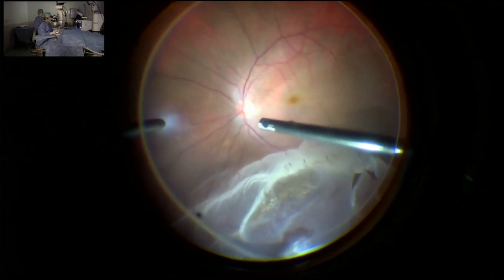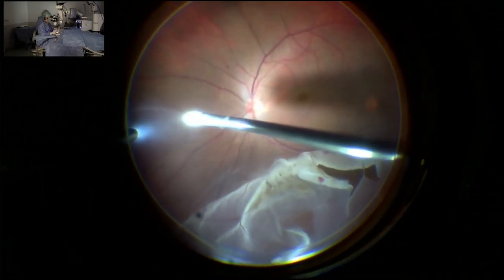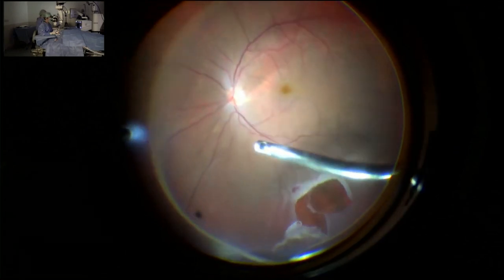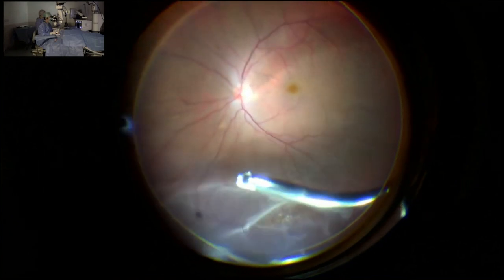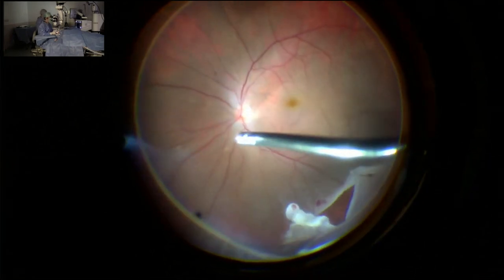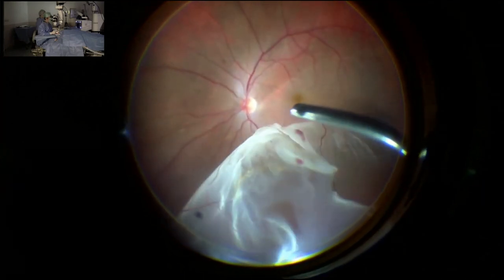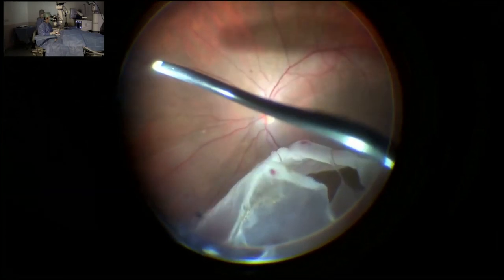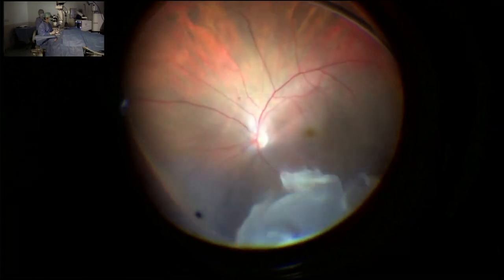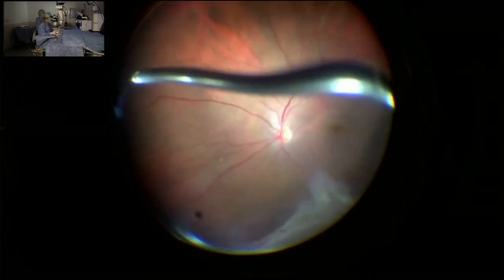So let me start to do the core vitrectomy first. I use a TDC 23 gauge cutter, and the cut rate is in total 16,000 per minute. The retina is very mobile. After the core vitrectomy, I will inject perfluorocarbon to reattach the retina on the posterior pole, and then continue to remove vitreous at the vitreous base. But first, we have to do the core vitrectomy. The view is clear in the auditorium. So I think it's clear enough if there is no complaint.